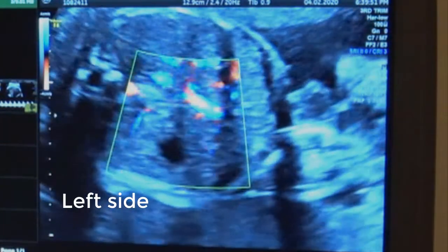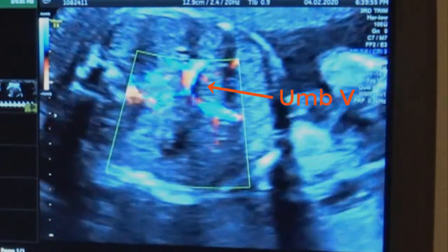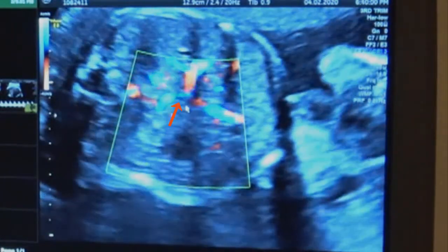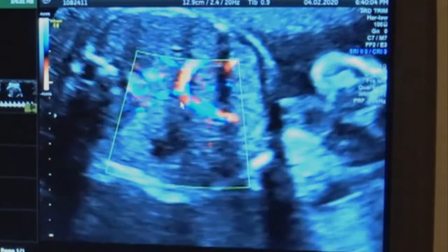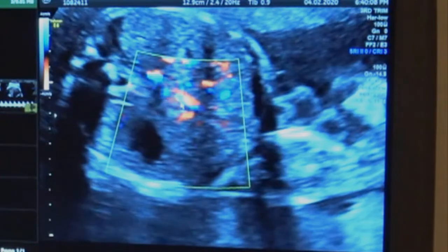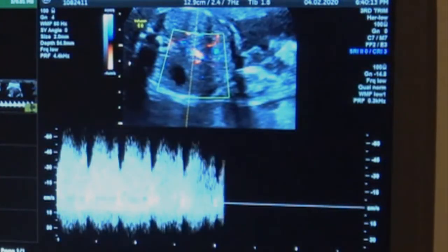You've got the loop of the umbilical vein. It comes off, curling, pretty much just coming towards the stomach. See that little one that's sort of aliasing right there? And are you moving south, like down to the pelvis from the arch view? Or up?